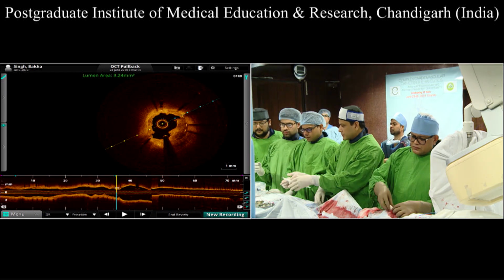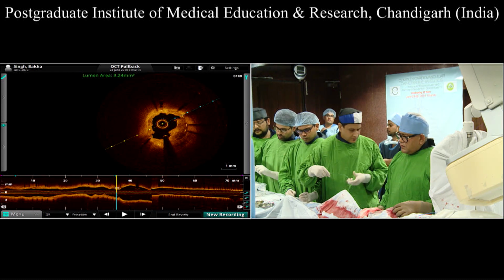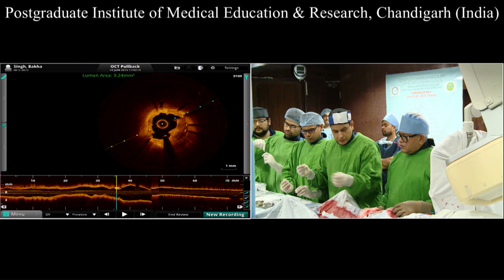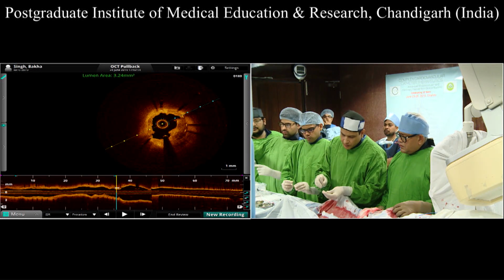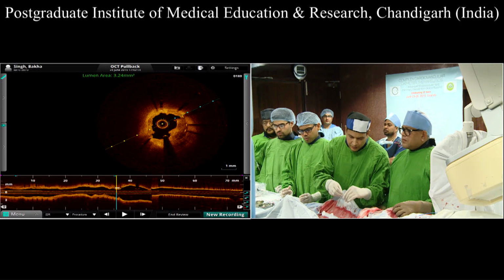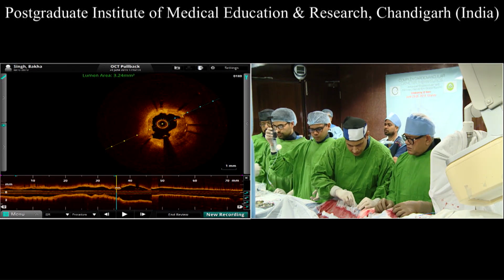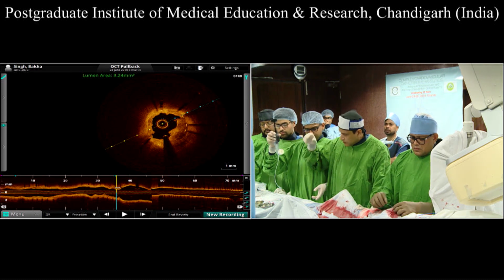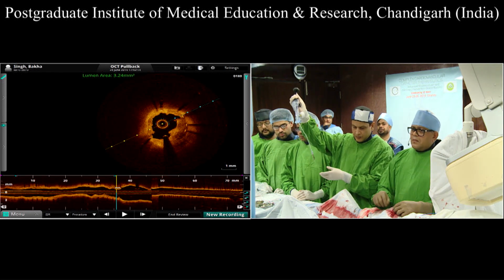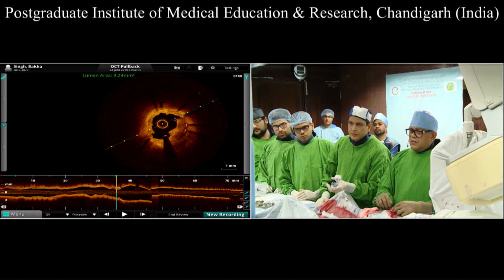There's not really a very good answer to that in this type of fibrotic lesion if we need to pull out the really heavy tools. I think the question here is how far can you get with your plaque preparation also using your regular non-compliant balloons, maybe scoring balloons if you have access to that. The crucial OCT evaluation step is the step immediately before you want to implant the stent, where you check that you have now achieved sufficient expansion of the old stent and that you have dissected sufficiently the plaque material that you have in the lumen.